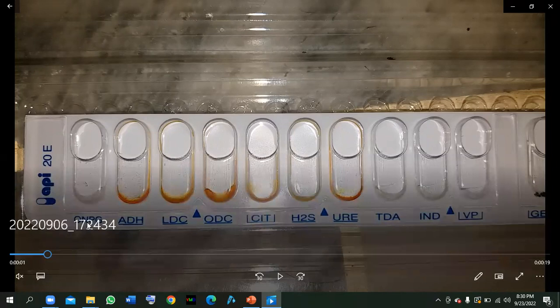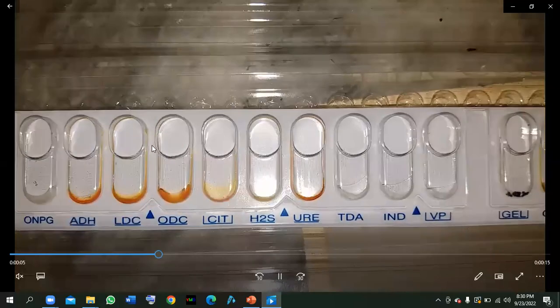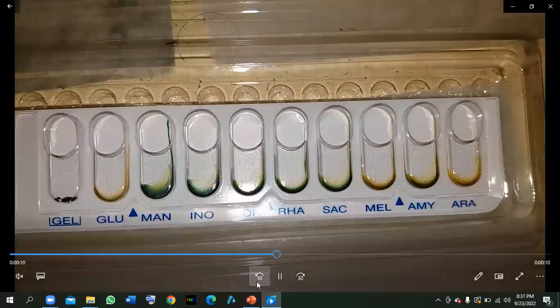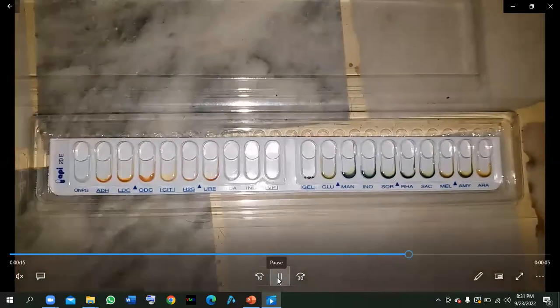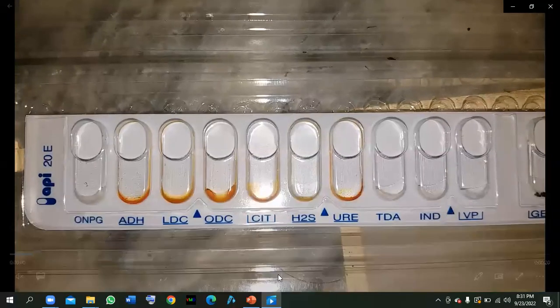These are the names of the tests: ONPG, ADH, LDC, ODC, citrate, H2S, urease. I will discuss them in detail. Let's look at this strip, and I will also show you how we inoculate it. This is the strip. You can watch the video. These are 20 tests. This is the strip.